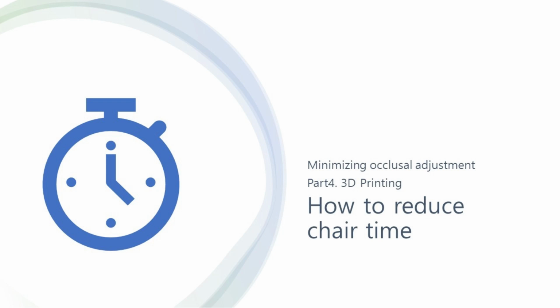We will explore various solutions to enhance the efficiency and reliability of 3D printed dental crowns. I am excited to share insights on overcoming these technical hurdles and how these improvements can lead to more efficient dental treatments. Let's embark on this journey to advance dental care through innovative problem solving in 3D printing technology.